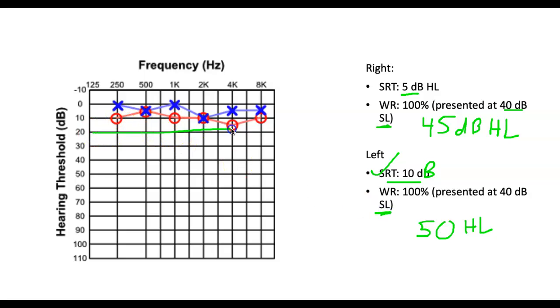And of course, all the scores for this one. This would be a normal hearing audiogram, but this shows how to calculate your word recognition level based on sensation level. But then also, if you took 5, 10, and 10, that's 25 divided by 3, which would be 8 point something, right?